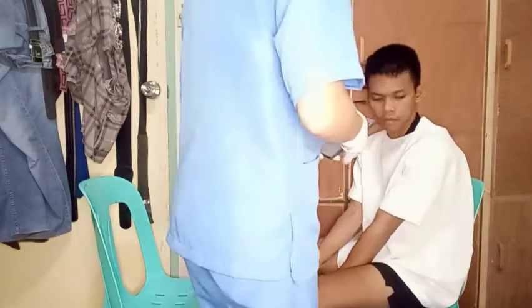Okay. So now after that, we will be performing the Rinne test by using a tuning fork again and placing the base on the client's mastoid process. When the client no longer hears the sound, note the time interval and move it in front of the external ear. And when the client can no longer hear the sound, note the interval. Okay, sir. So I will be doing the same procedure, but I will be putting the vibration on your mastoid.